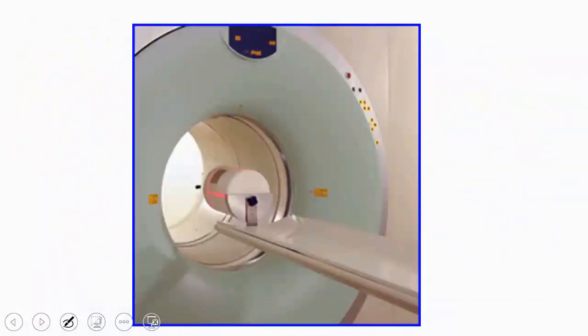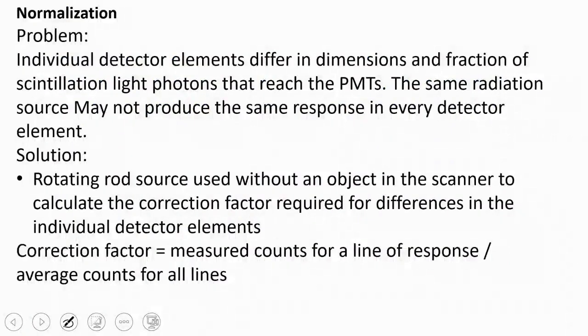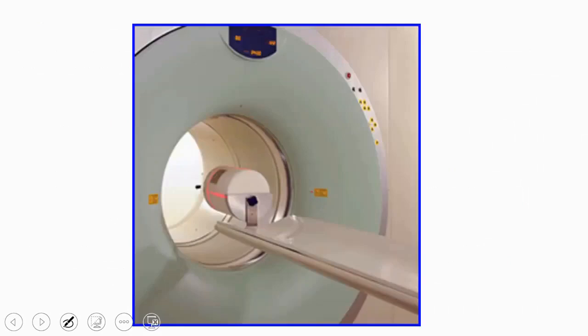Okay. There are some important things in something called, what is this topic? Today, you are telling me that you are a doctor, right? You are dealing with daily quality control. In daily quality control, you will find the technician using a radioactive source. This radioactive source emits positrons or 2 gamma photons at 180 degrees. Before we start working in the morning, he must perform calibration or conduct quality control.